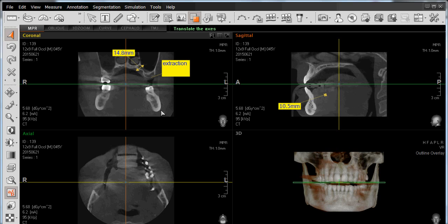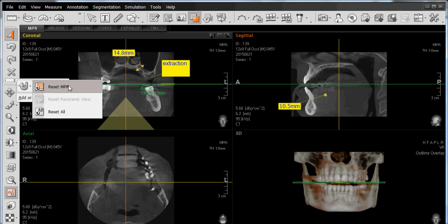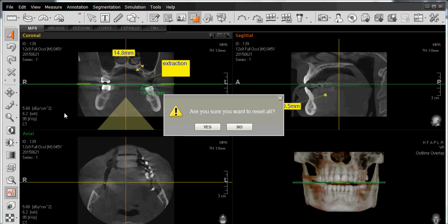However, at any point in time, if I decide to reset everything and go back to the very beginning — removing all notations, measurements, and any other treatment planning — I can left-click on Reset, navigate down, and left-click on Reset All. The software prompts you with a secondary question: are you sure you want to reset everything? Note: if you have not saved your work with a project name, selecting Yes will remove everything and there is no undo or reset available for this.